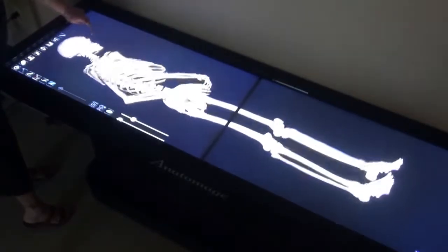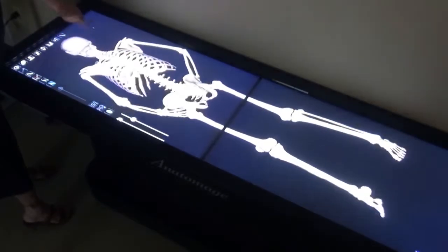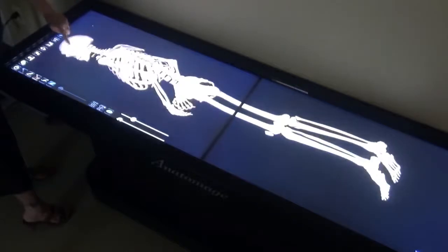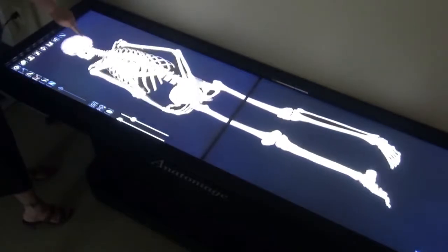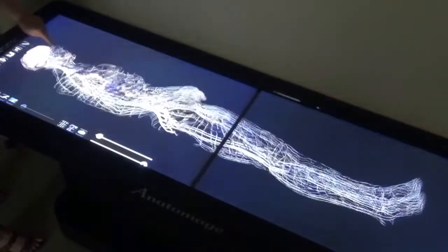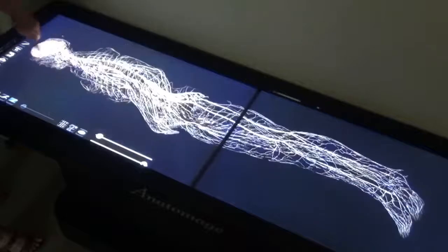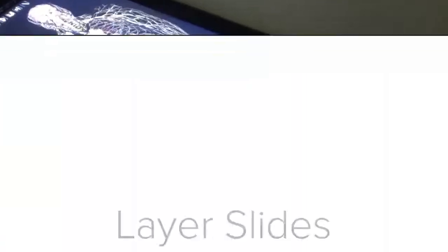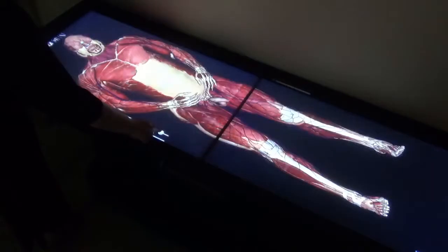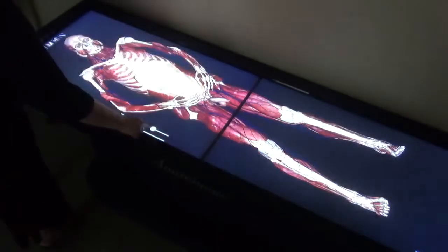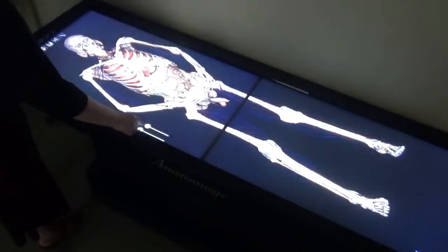Students and faculty can rotate virtual and cadaver bodies a full 360 degrees. Gross anatomy slides allow students and faculty to visualize full body structures.